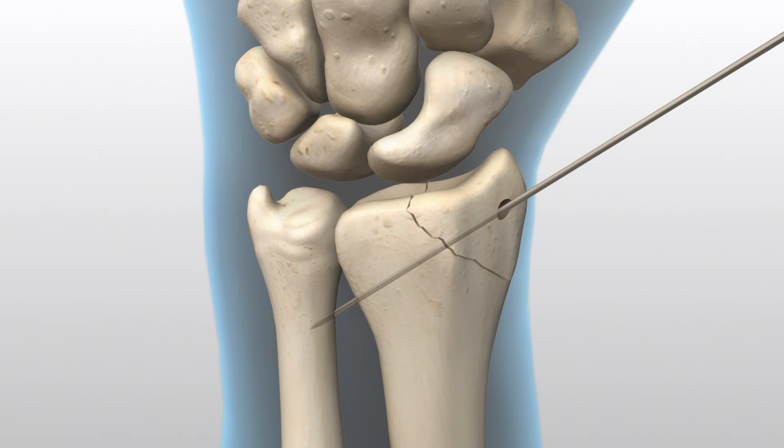When using the long drill, advance the guide wire and drill into the far fragment.